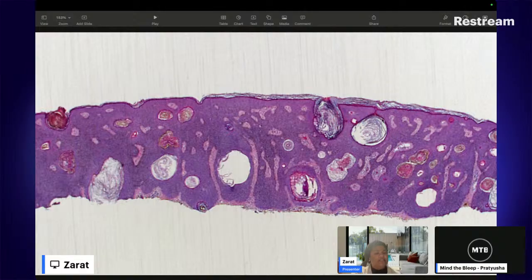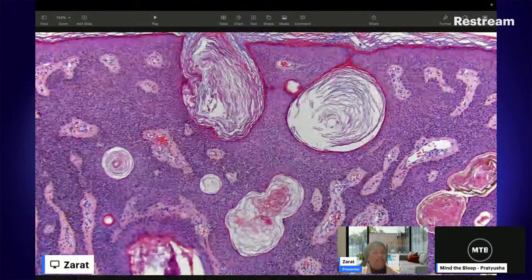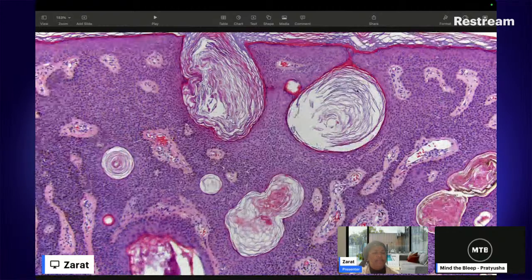These are these cyst-like things with keratin, and the things within these cysts look very similar. They are keratin. So the keratin at the top, this is the keratin within it. So we have some keratin-filled cysts. We have a much thicker epidermis than we would expect, lots and lots of keratinocytes. So something is happening. And then the question is, is it benign or is it malignant?